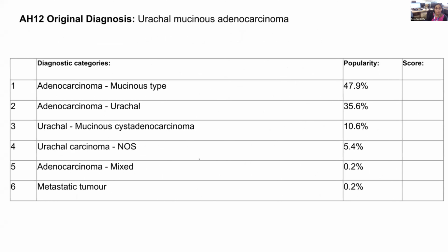Do we want to mark it or just combine all of it? Because in a way, they are all trying to say the same thing. I guess number 6 is a bit ambiguous. Do you think? But they probably might be meaning metastatic tumor from the gastrointestinal tract, which can't be excluded. And again, mucinous adenocarcinoma, though there was not a cyst, but we don't have an option of mucinous adenocarcinoma. So, I don't know how.